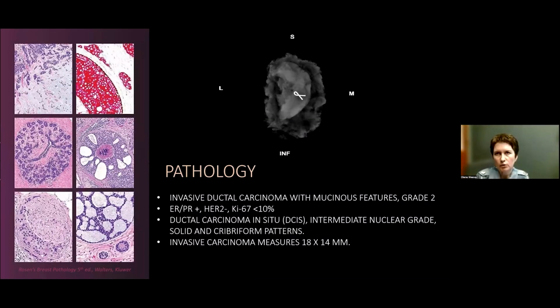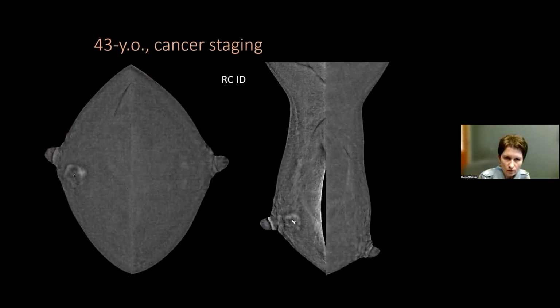So basically, I just wanted to emphasize the possibility of doing contrast-enhanced mammography on patients with implants. Also, you may notice on these images some very faint vertical dark lines. That's a grid artifact of recombined images. It's not really preventing us from making an adequate diagnosis. It doesn't make the study non-diagnostic, but it's visible. So if you know what it is, you can contact your vendors and work on that, or just work around it.